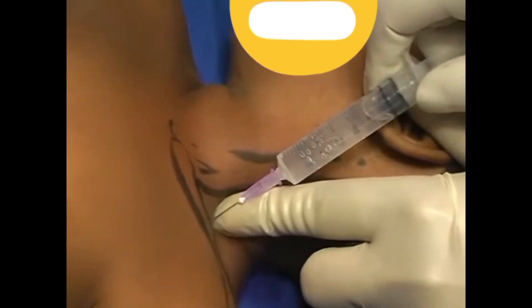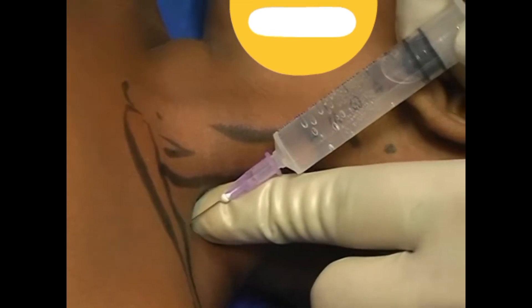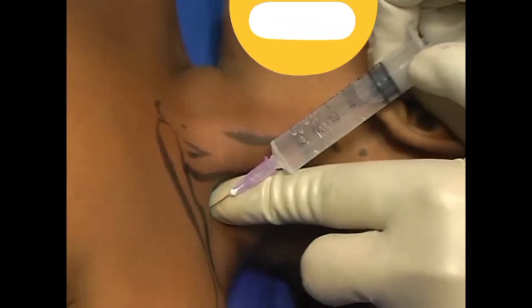And start injecting in the groove. Aspirate and inject. Aspirate and inject.